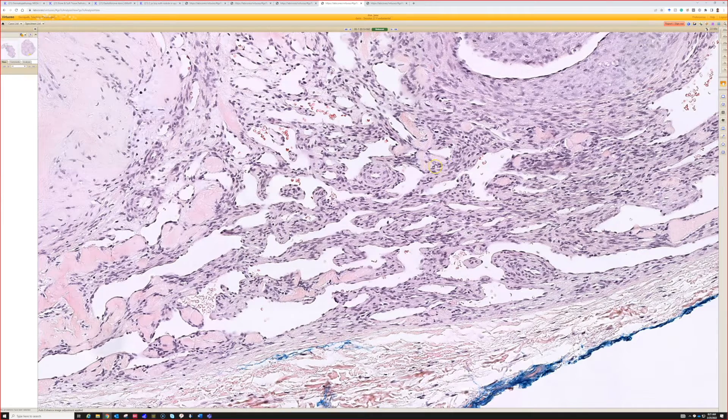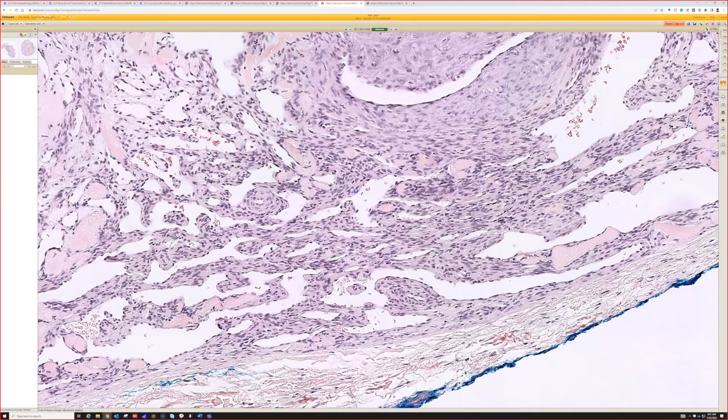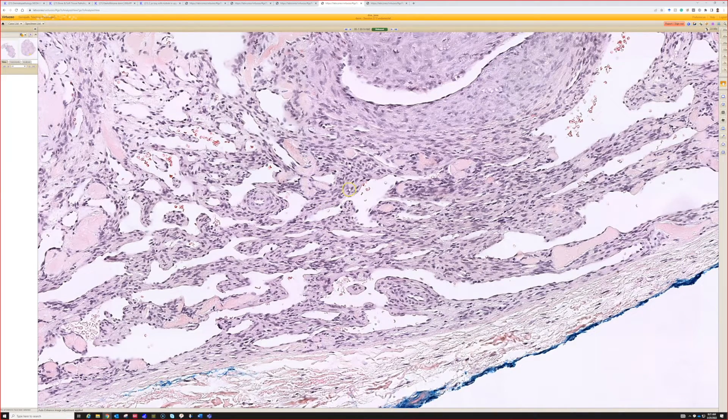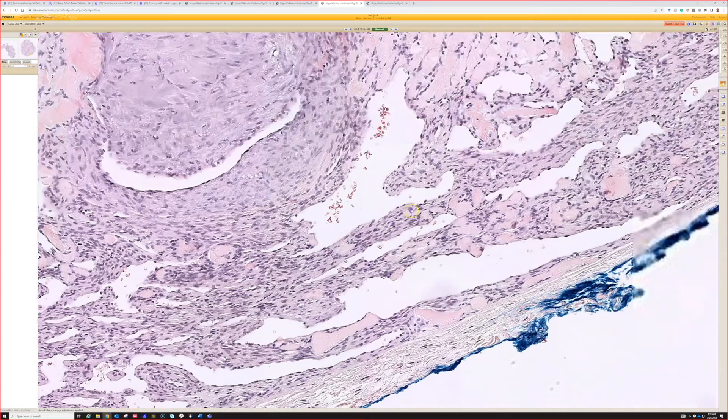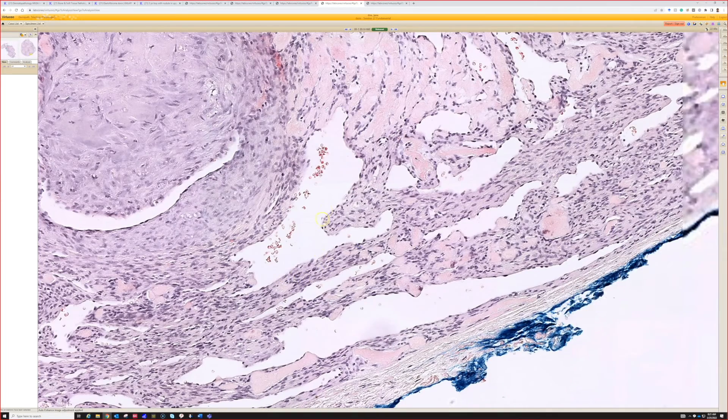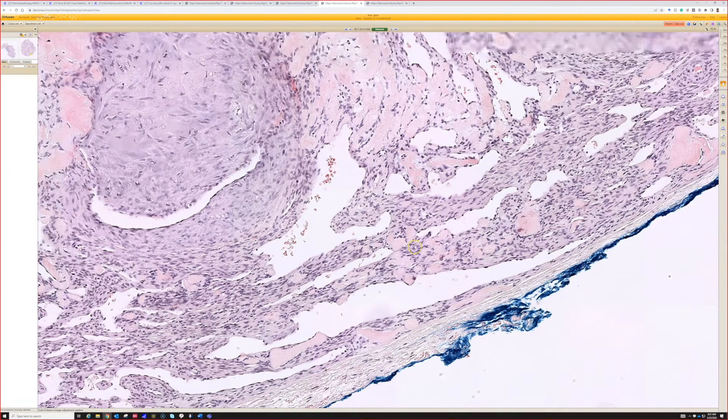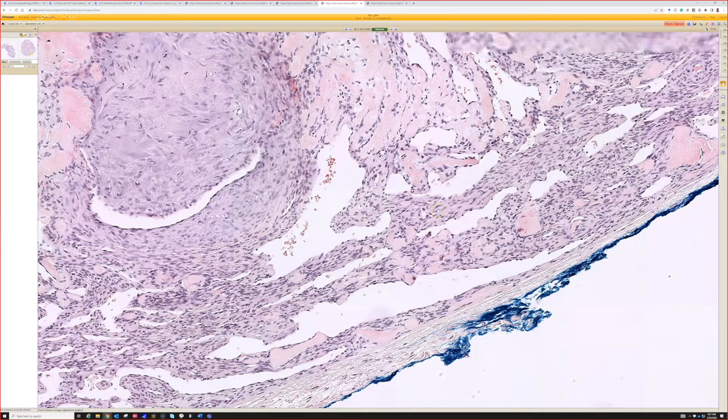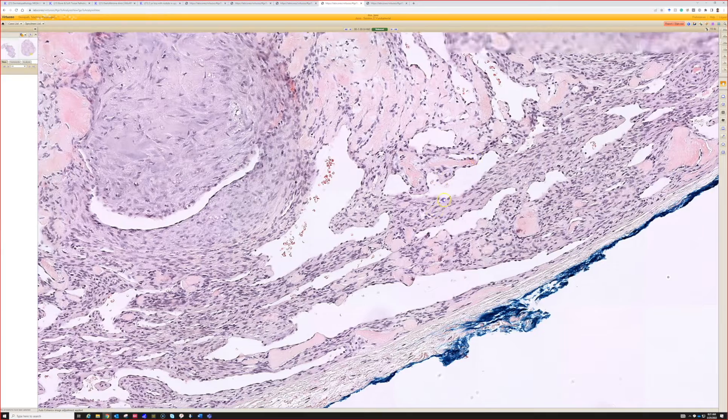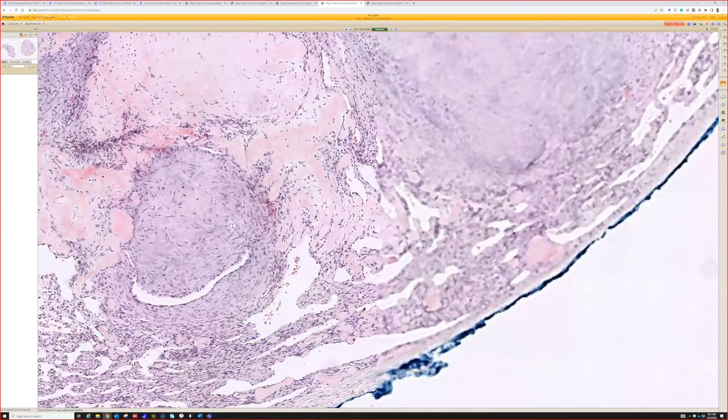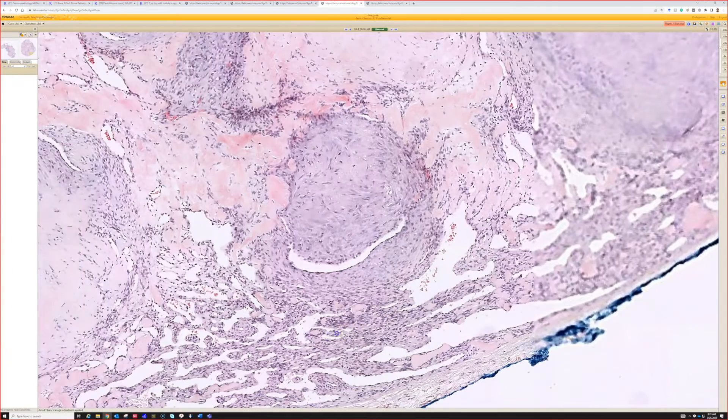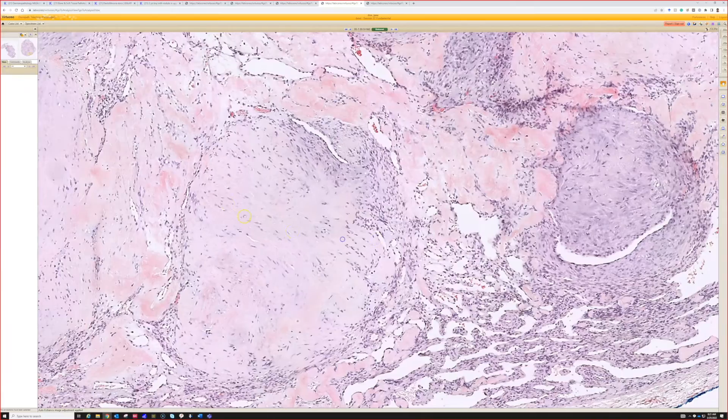After the old tumor hemangiopericytoma that we now call solitary fibrous tumor, lots of different tumors including this one can have that staghorn hemangiopericytic vascular pattern of branching antler-shaped vessels. And then bland spindle cells.